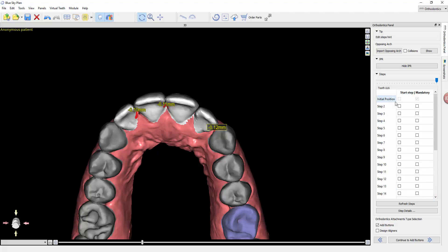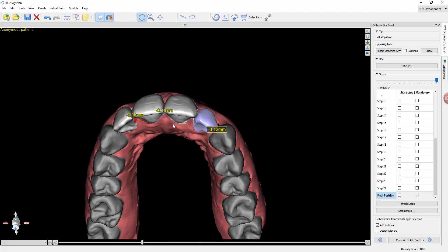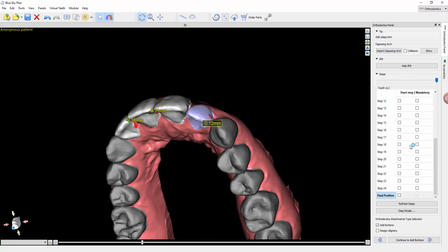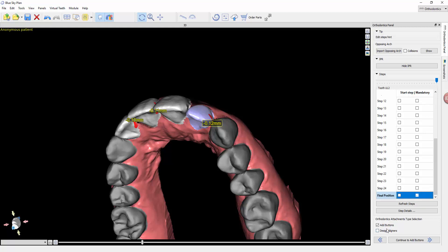One note: if you notice a tooth that overlaps too early or moves into each other, you can use these various options to select when teeth move. That's what these checkboxes are for. We'll go over that in more detail in another video in the future.